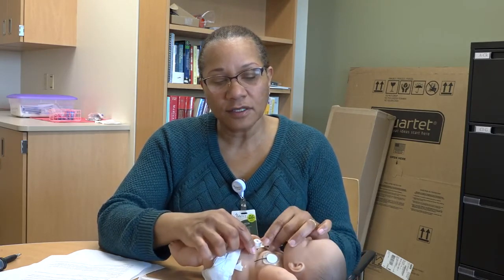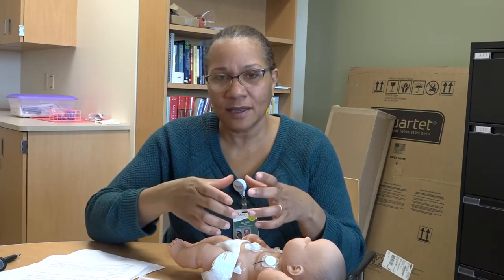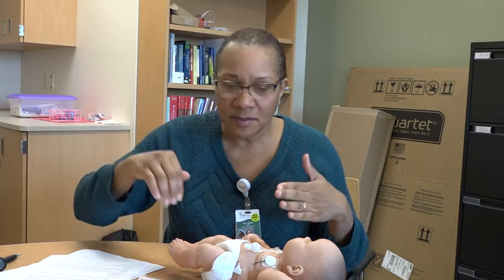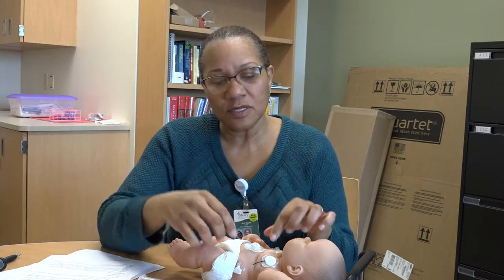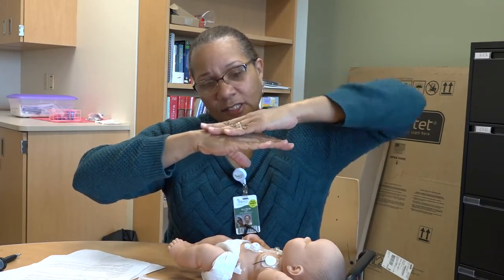The reason why granulation tissue causes more leakage is because granulation tissue very seldom comes in the same way all the way around that site. If you think about the site as a clock, granulation tissue sometimes will grow maybe from 12 o'clock to 4 o'clock, and maybe the rest of that G-tube site area doesn't have any granulation tissue at all, or that area, the granulation tissue may be thicker than in the other areas around the G-tube site. So that keeps the G-tube from fitting flush up against the skin. It kind of sits a little off because of the granulation tissue. So of course that can cause more leakage.